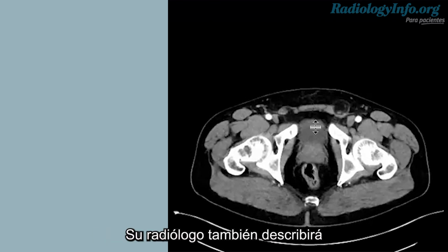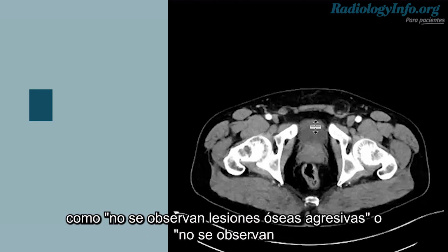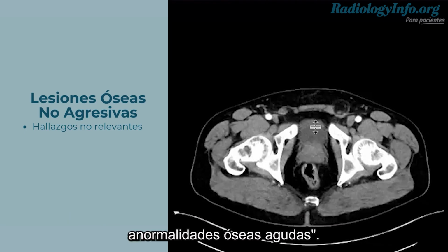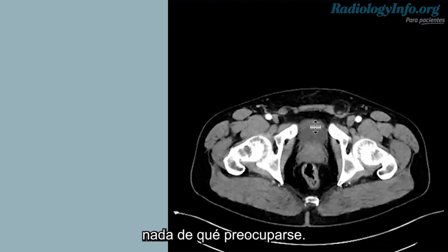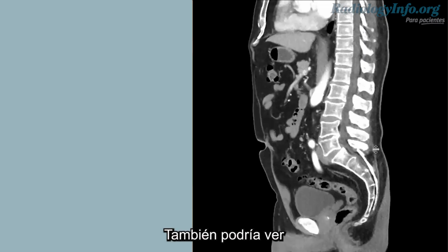Your radiologist will also describe any findings in your bones. You may see a term such as no aggressive osseous lesions or no acute osseous abnormality. This simply means the radiologist has not seen anything of concern in your bones. You may also see some discussion of arthritis in your spine or your hips in the report. Some radiologists choose to mention this, others may not.